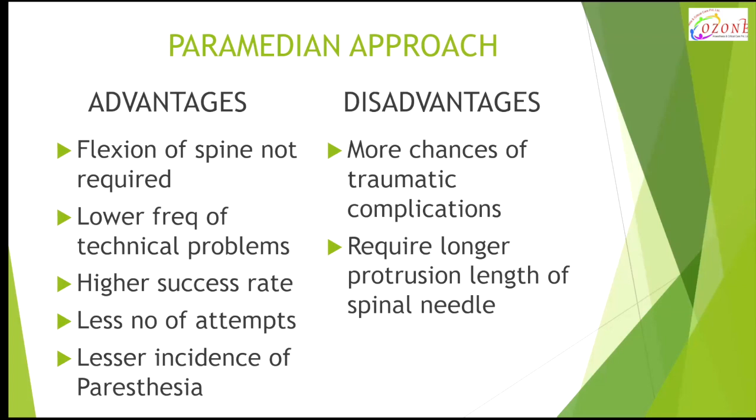Disadvantages are more chances of traumatic complications in the paramedian approach, and it requires a longer protrusion length of the spinal needle. Next slide, sir.